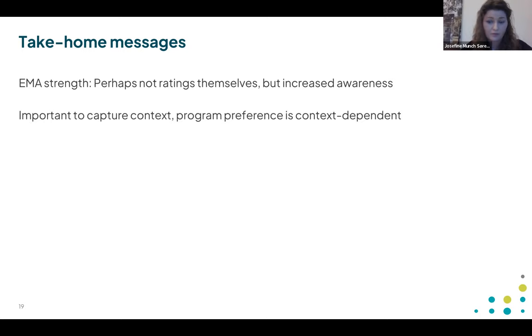We also found that without capturing the acoustical context that people evaluated these programs in, it was quite difficult to say anything meaningful about these ratings. So again, it's important to capture the context in which people are evaluating the programs.